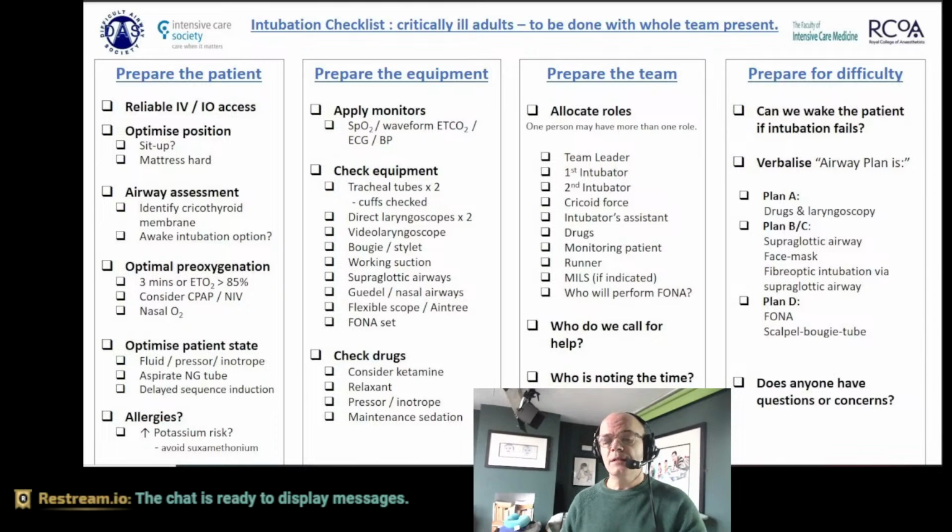Again, it might be that the team who are looking after the airway may want an arterial line to be put in, so that we've got beat-to-beat measurements, easier to take gases, easier to take bloods, that kind of thing. But sometimes it may be that if we can get the cuff just to cycle very regularly, and we're reasonably happy that it's giving us reliable measurements, and it's not on the side that we're giving the drugs through.